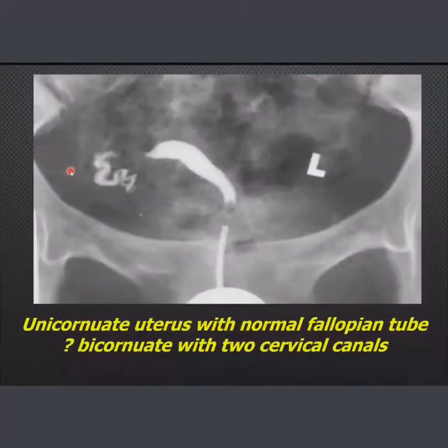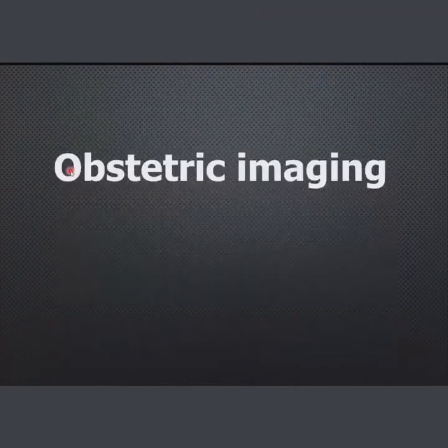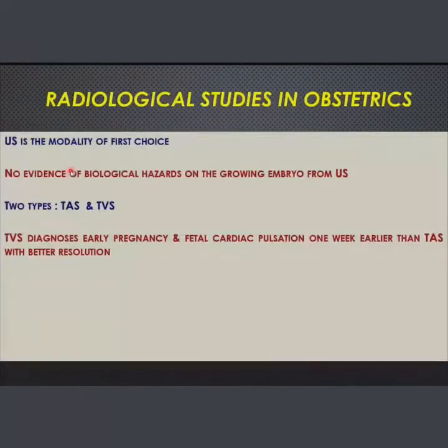وعرفنا انه شلون الهستروسالبنجيوغرافي والمين انديكيشن مين كرنت انديكيشن اوف هستروسالبنجيوغرافي. طبعا هذا البروسيجر performed by insertion of cannula into the cervix and injection of iodinated contrast medium and then filming fluoroscopy. Fluoroscopy يعني movie, X-ray movie to show the progress of contrast through the tubes.